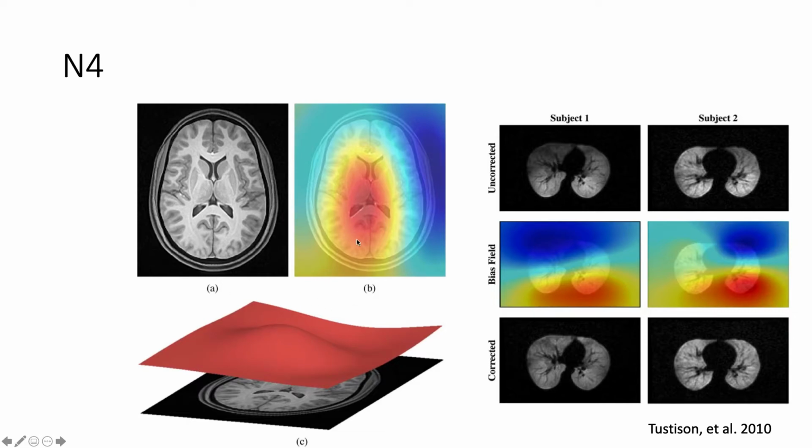But you can see it up here, where they identify the source of the change in intensities, and they apply that to the brain, and then you get a cleaner, more uniform brain out, which is going to be really important for registration, both anatomical and also applying your EPI to your anatomy. And this is really important if you're doing morphometric registration in particular.